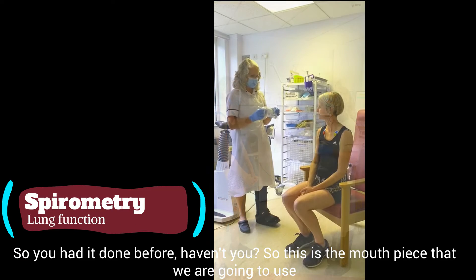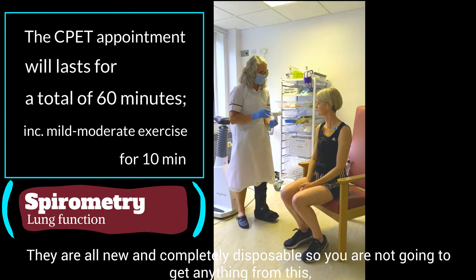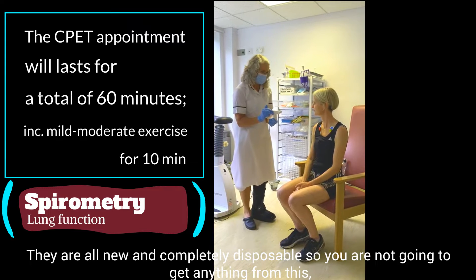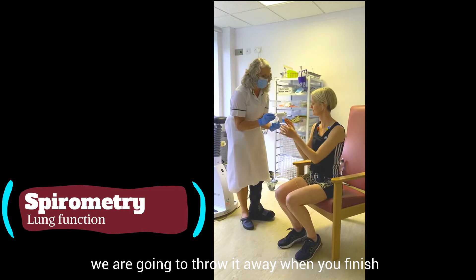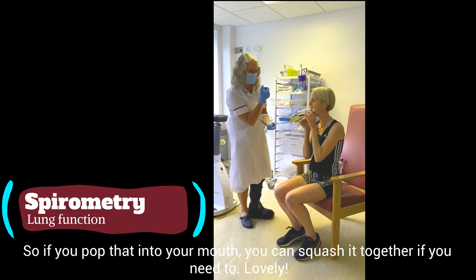So you've had it done before, haven't you? This is the mouthpiece that we're going to use. They're all new and completely disposable, so you're not going to get anything from this — we just throw it away when you're finished. So if you could just pop that into your mouth; you can squish it together if you need to.